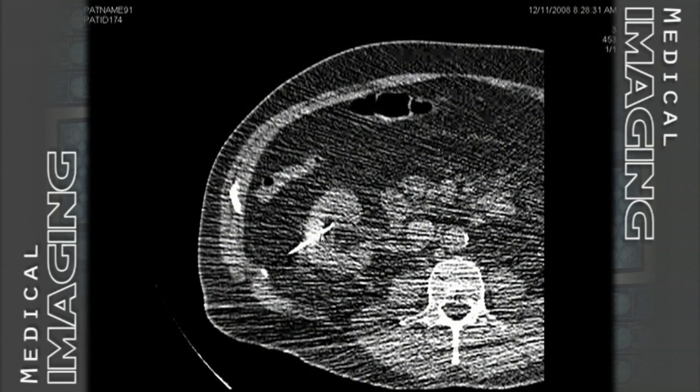Keep in mind this is a functioning kidney, and the probe has gone through at least some partially healthy tissue, so there may be some bleeding and complications. At all times, without CT guidance, this procedure would really not have been possible. These probes are small and thin, and it's unlikely that they would really get a good image under any other modality but CT.